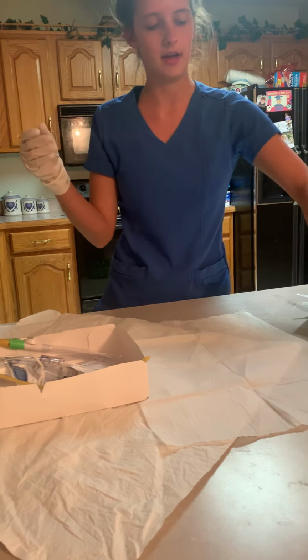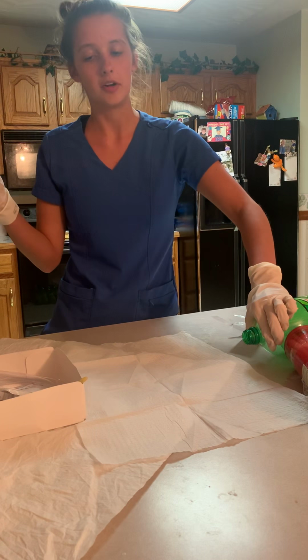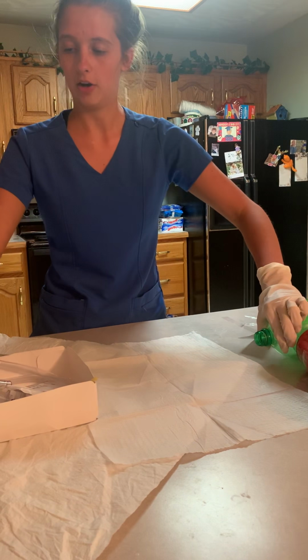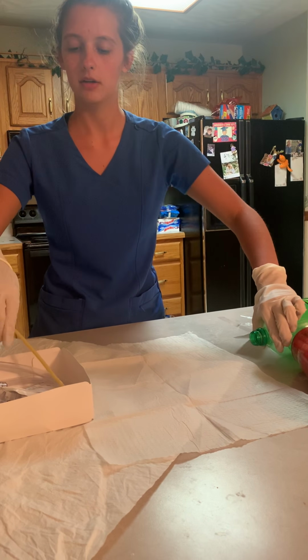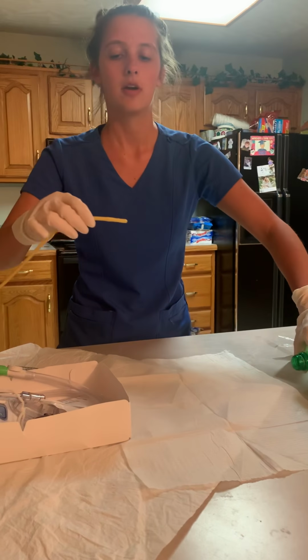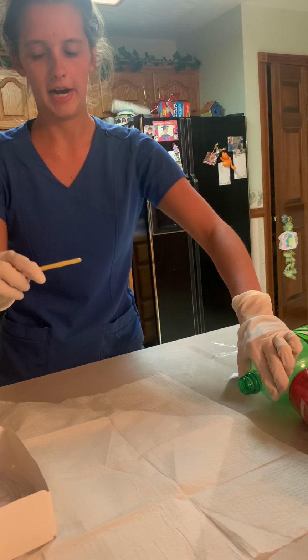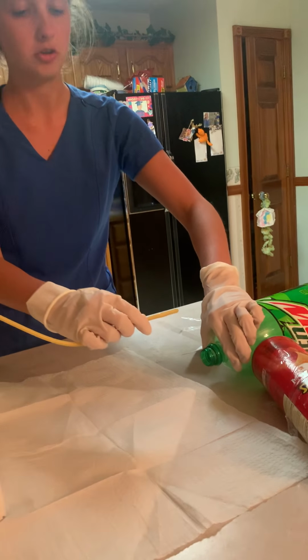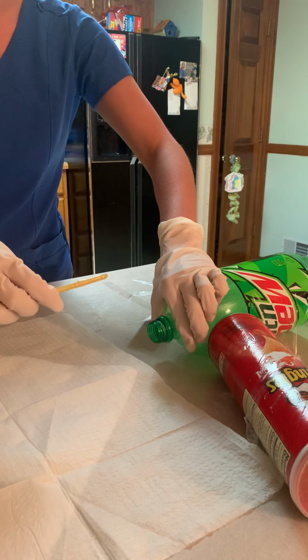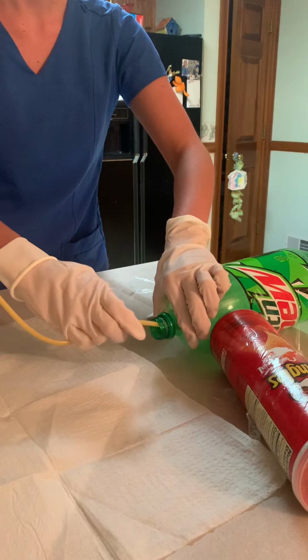Again, we have the penis at a 90-degree angle, and whenever we insert the catheter, we're going to instruct the patient to take a deep breath. Whenever I grab the catheter, I'm going to grab it no more than 2 inches from the tip. So now we are going to instruct the patient to take a deep breath. And while doing this, we're going to make sure that we do not touch our sterile hand against the penis. So we're going to now go ahead and insert.